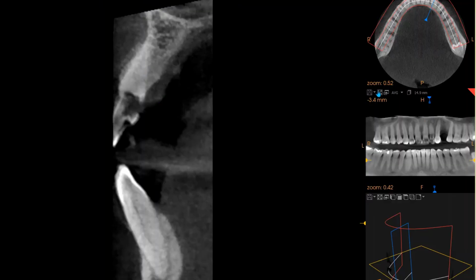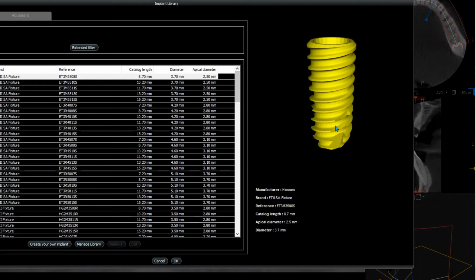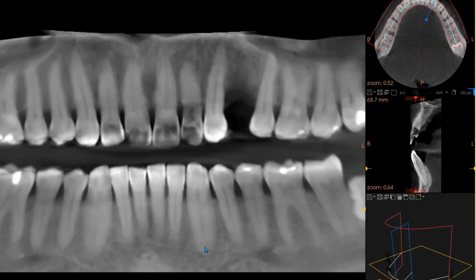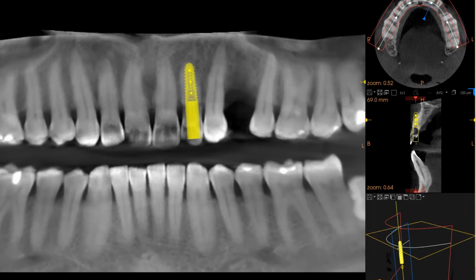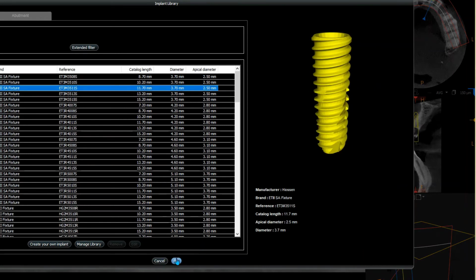So if we go back to where would we place the implant, and then what size implant and things like that, let's go back here, and now we can grab an implant, and it's going to be a small diameter implant. This one actually looks really good size. That is a 3 by 8, let's say a 3 by 10. So we can put that one in, and maybe longer. Let's change that. Not giving me a change for some reason. Let's say an 11.